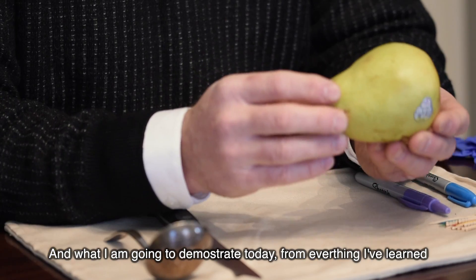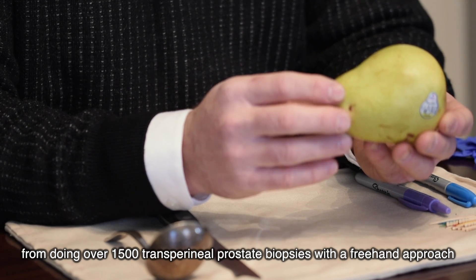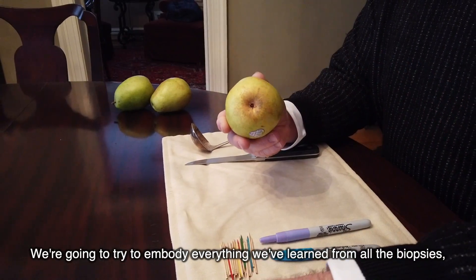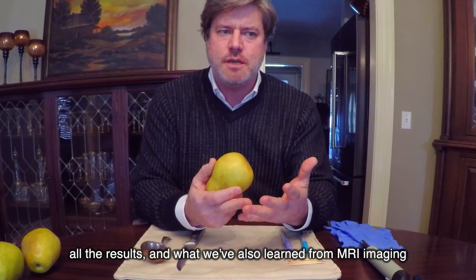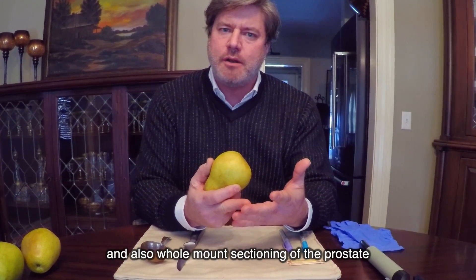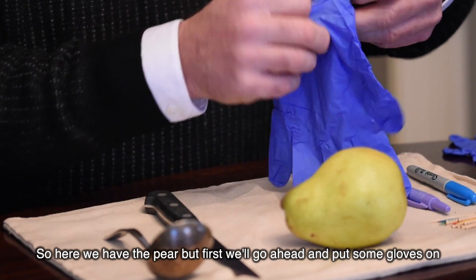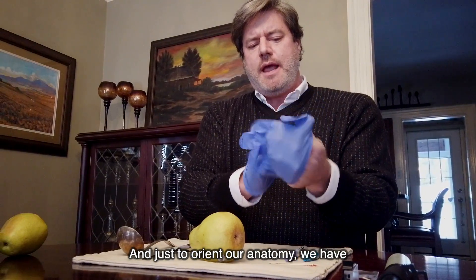I'm going to demonstrate today from everything I've learned from doing over 1500 transperineal prostate biopsies with a freehand approach and also using the precision point transperineal access system. We're going to try to embody everything we've learned from all the biopsies, all the results, what we've learned from MRI imaging, and also from sectioning of the prostate. But first, we'll go ahead and put some gloves on.